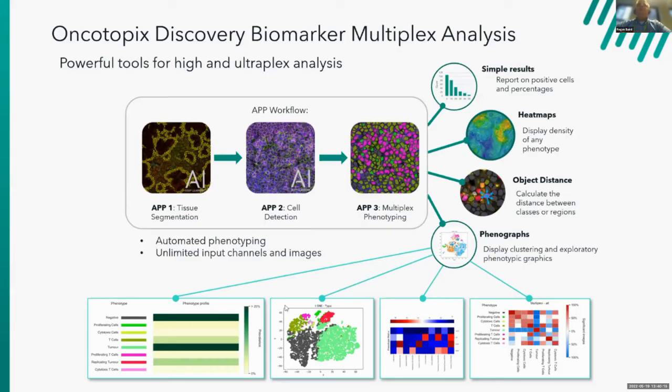This actually becomes the most important step in any downstream phenotyping analysis that we want to do, because anything that's contained within the boundaries of that object or that cell, any of the signals contained within those boundaries, are going to be assumed to be a part of that cell. And so we really need to understand how to do the best segmentation of each object or each cell in this particular example. In fact, this can be the most challenging part of all of image analysis in tissue today. I'll show you a little bit more about how we can approach this with the Visiopharm software.